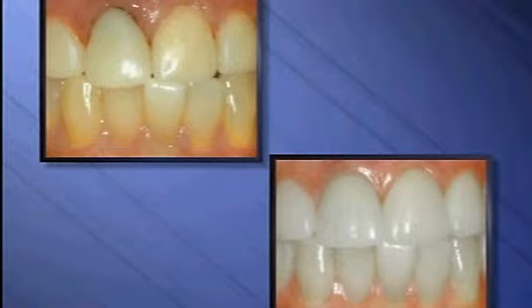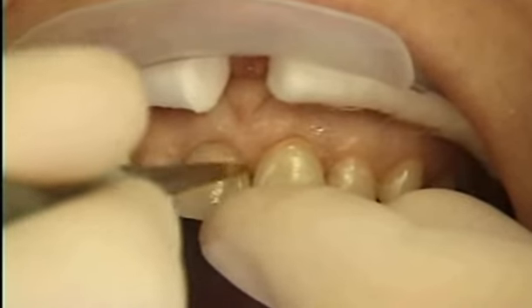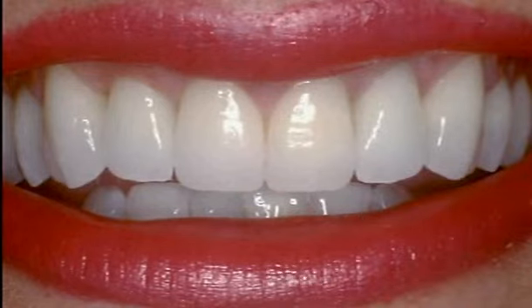This allows us to place the edge of the crown above the gum line, and that's healthier for your tooth and gums. When you want to improve your smile, all-porcelain crowns are a beautiful and natural-looking choice.